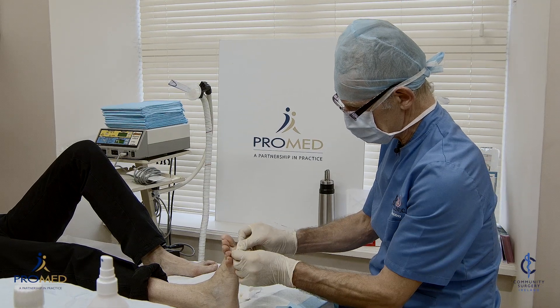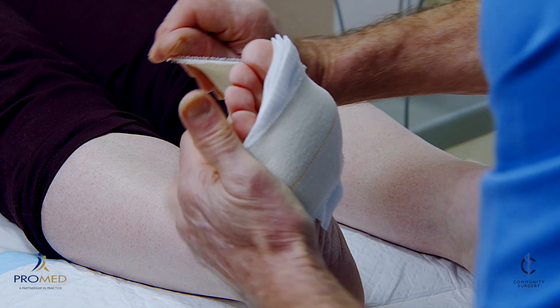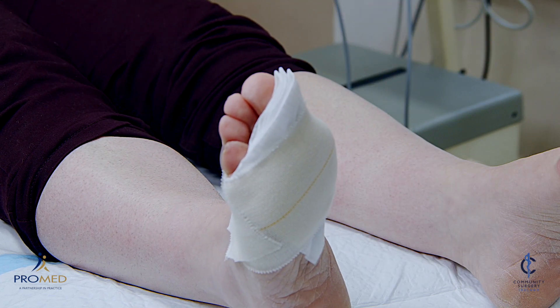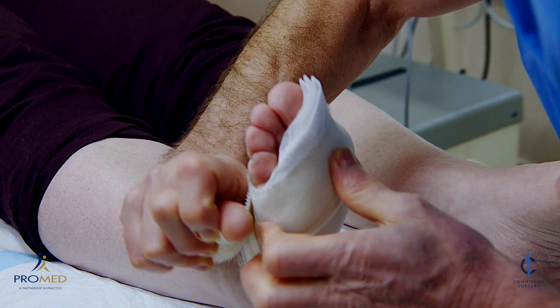So a little bit of alginate just in case it bleeds, a little bit of dry dressing, and a bit of pressure. A bit of tape — actually no, we don't need it, it's fine. A bit of tape. So we've got rid of all our sharps.